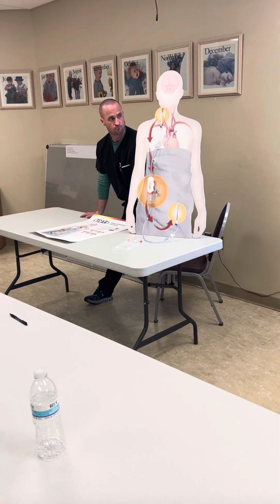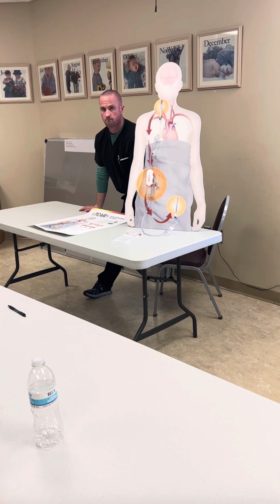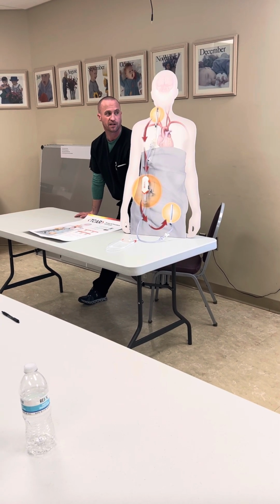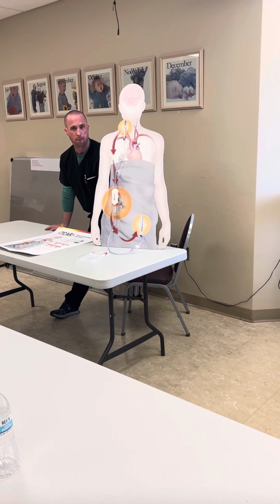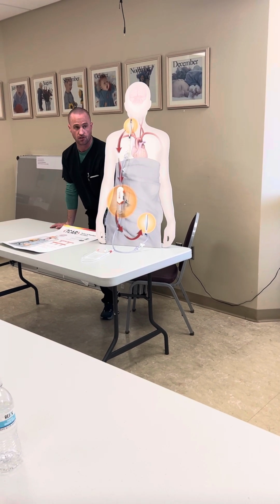It's a small artery tray. Okay. I'm just gonna make sure the card is. Yeah, that tray was Riser's tray before he left, and so most of the stuff is still the same. And you're still going to get a TCAR cart for us, correct? It's here. Oh, great. It's here, ready. Yep. Perfect. Yeah, the TCAR cart is upstairs.